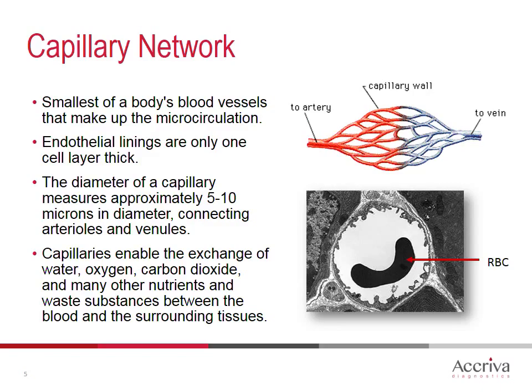In addition, most oxygenation studies are used not only for their individual value, but for trending. So if on one stick you just happen to get closer to the arterial side, you can't guarantee that on your next stick. And if you're then going to trend that information, you can get false or erroneous trending, which could lend your patient management one way or the other. So we don't use capillary sticks for oxygenation measurement.